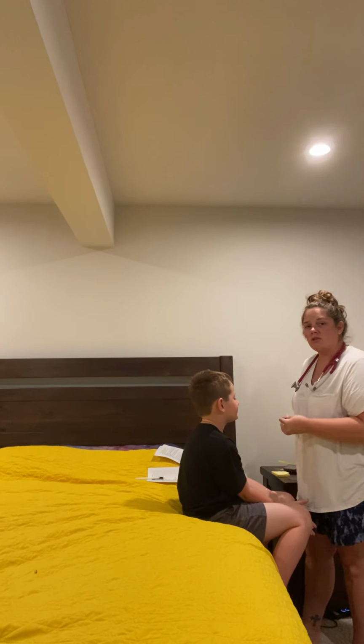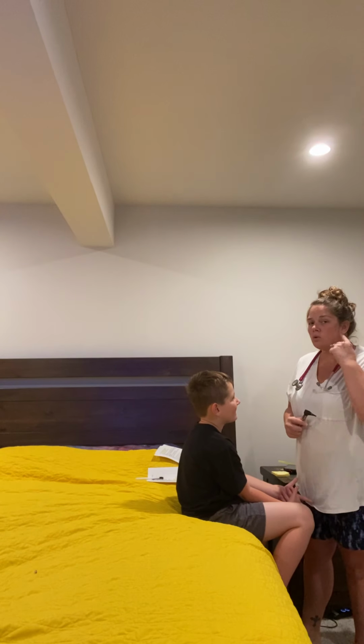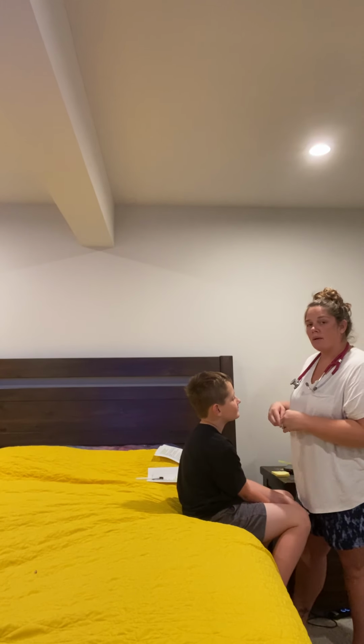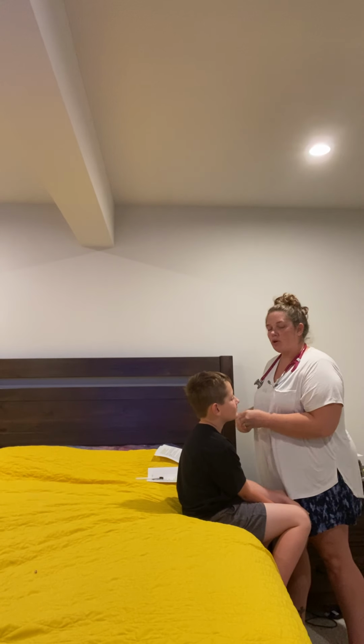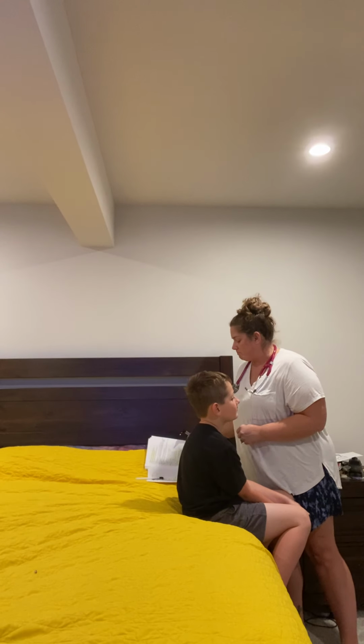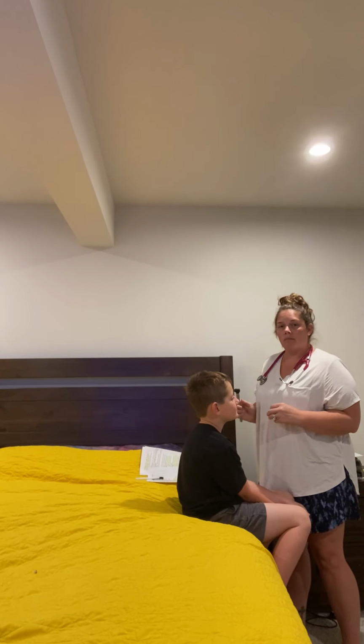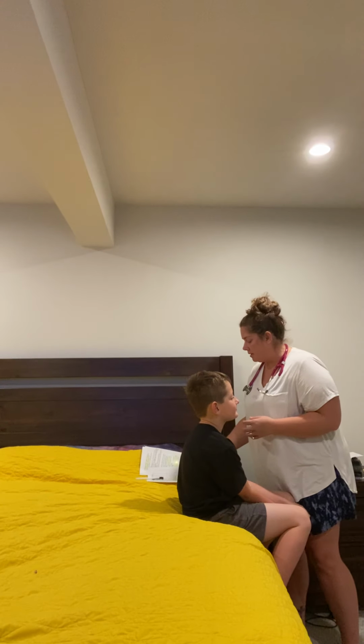Okay, and now I'm going to check into his ears, and when I do, I'm going to be looking at his auditory canal and his tympanic membrane, and I'm ensuring that it is pearly gray and that the cone of light is in the correct position according to which ear I'm looking in.